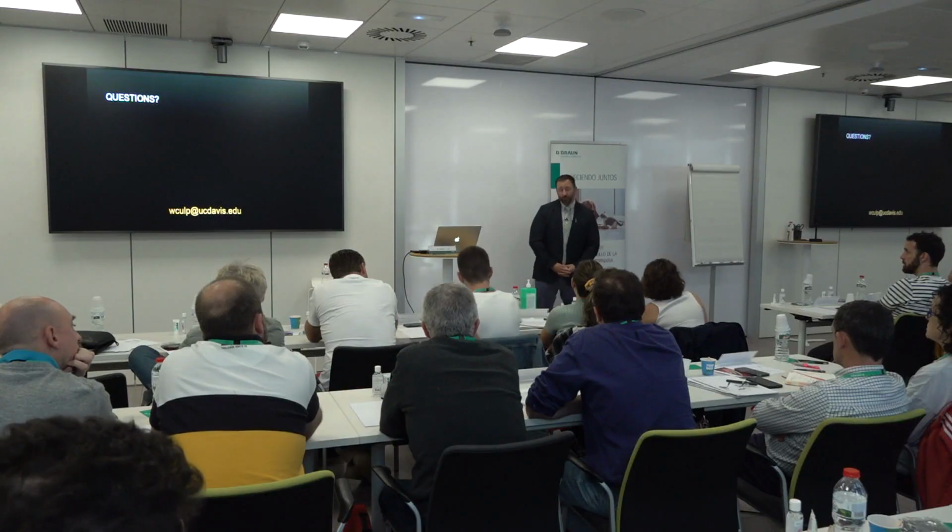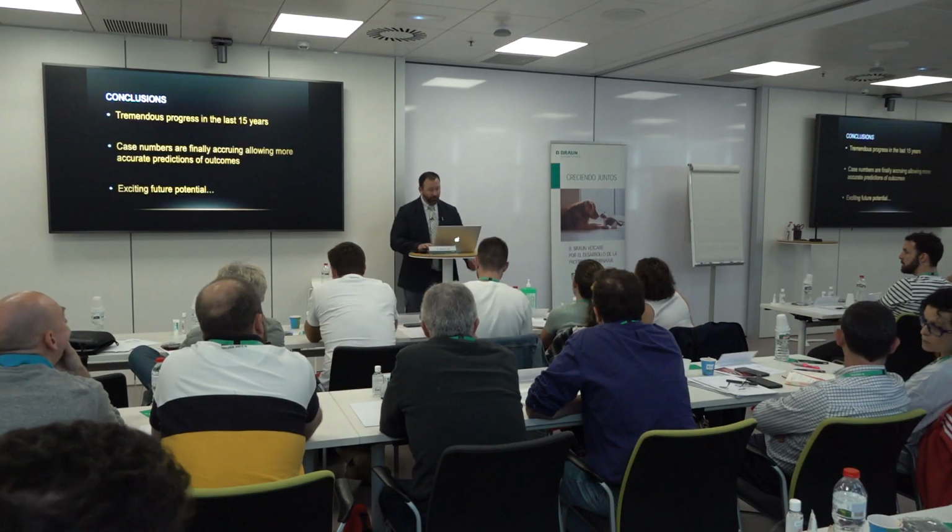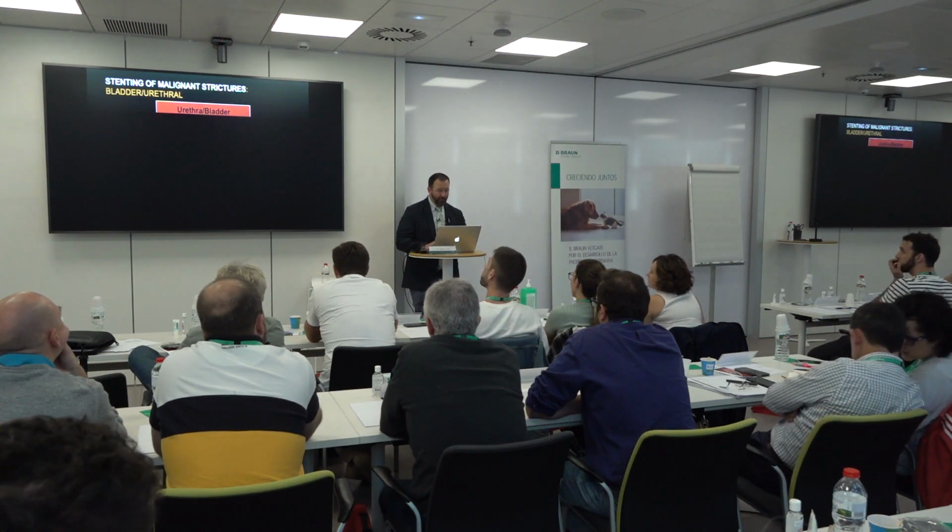Yes. It's actually a little bit easier to do your contrast studies in females. So here's that female case again. Let's see if I caught it here. Yeah, so this contrast study is actually through the sheath. If you look really close, you can see the edges of the sheath here and here, and I think it extends up there. So we do it through that side port of the sheath.